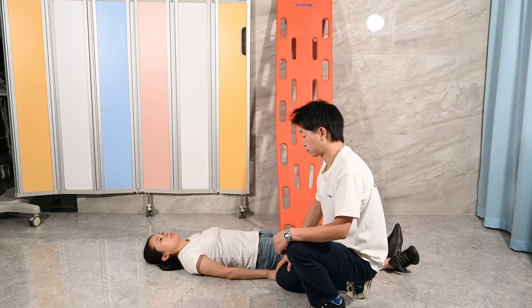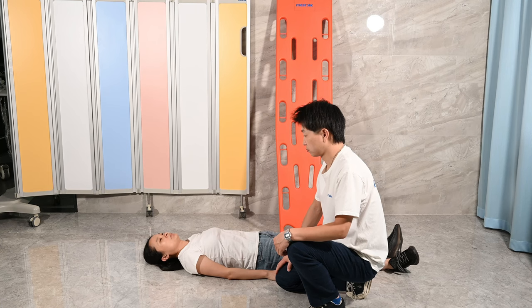Hello everyone, today I am going to demonstrate how to extract a patient on the spinal board. Firstly, we need to check the PMS feeling for the appropriate fingers and feet.